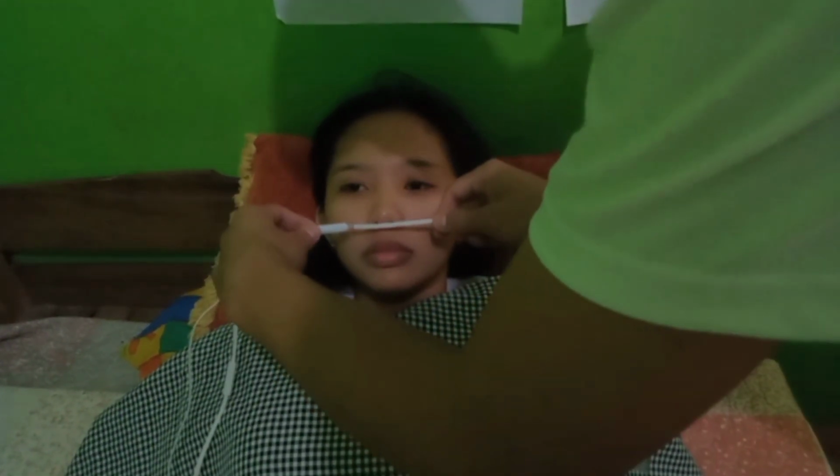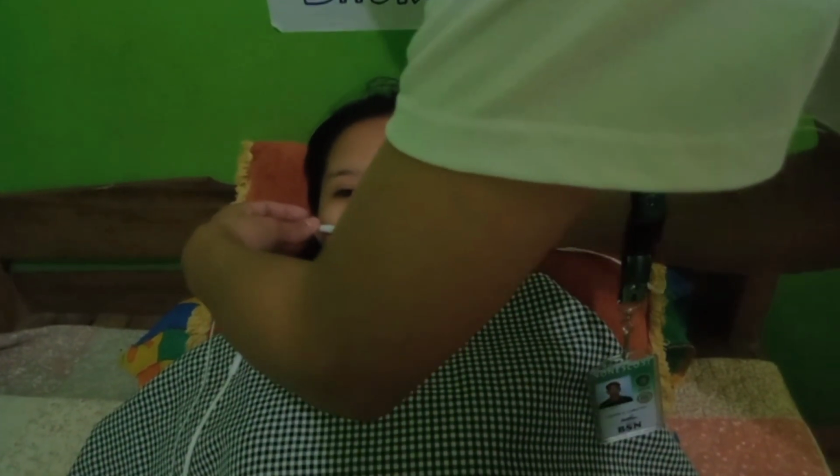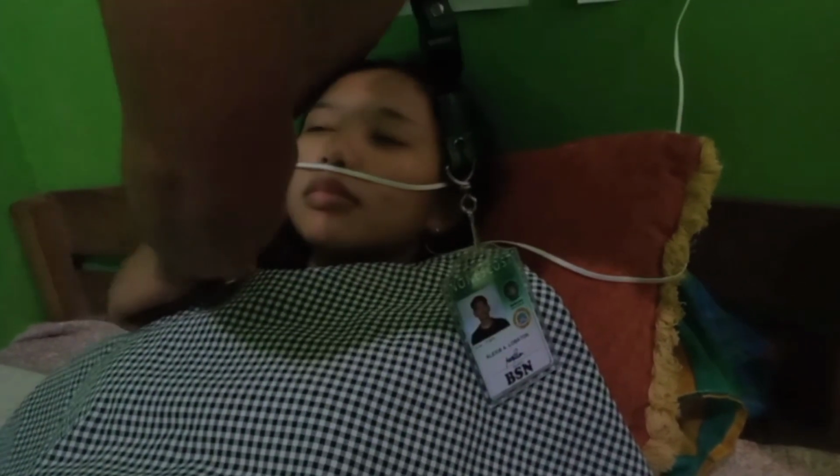Hold nasal cannula in proper position with prongs curving downward. Place cannula prongs into nares. Wrap tubing over and behind the ears. Adjust plastic slide under chin until cannula fits snugly. Place gauze at ear beneath tubing as necessary. Proper placement in nares ensures accurate administration.